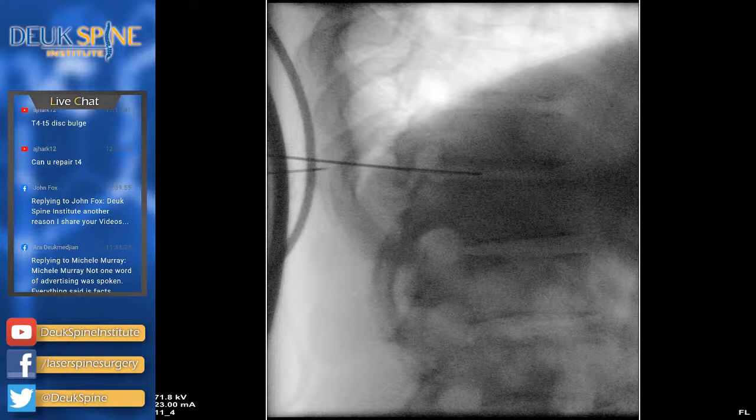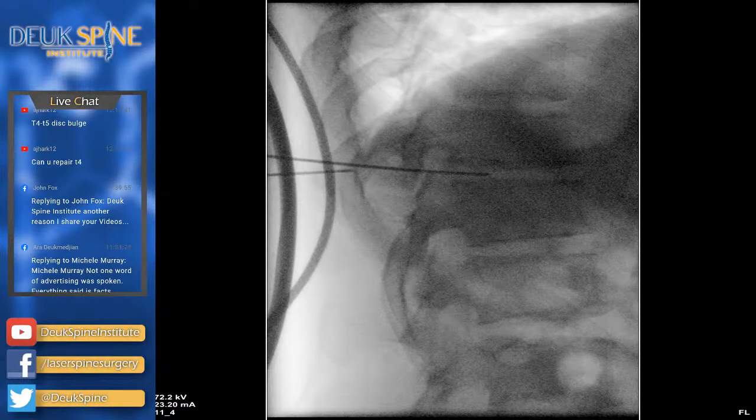one of the things you learn as a surgeon is where pain fibers are. You see, pain fibers are how patients are able to feel pain. And pain fibers are nerve fibers. Nerves are the little wires in the body that transmit pain signals from a body part to the brain. And we learn where the pain fibers are. They're not everywhere, believe it or not. That's the first thing you should know. They're only in very specific locations, and one of them is fascia, the thoracic fascia. All right, so I'm trying to numb that up for him and make him more comfortable.